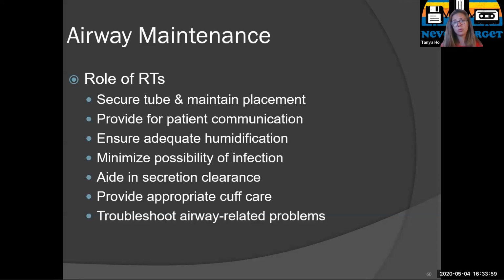So try to do some troubleshooting and communicate with your patients. They cannot talk to you and you cannot read lips. They also have an endotracheal tube in place. You cannot read their lips. It's awful, okay? And then they just get frustrated and disheartened, and it's really sad to leave them in the room when they're like that. Sometimes the nursing staff is better at reading lips than we are because they're with the patient so much, so they get pretty good at that.